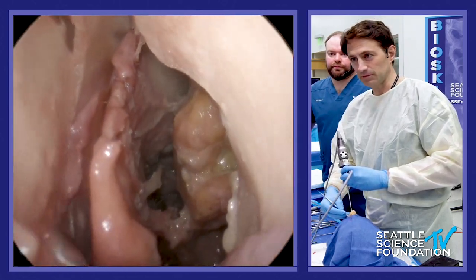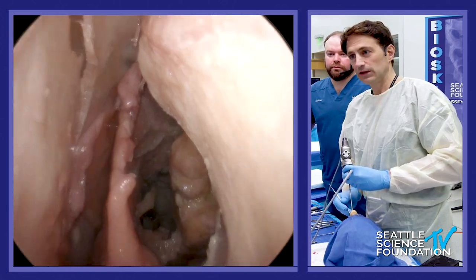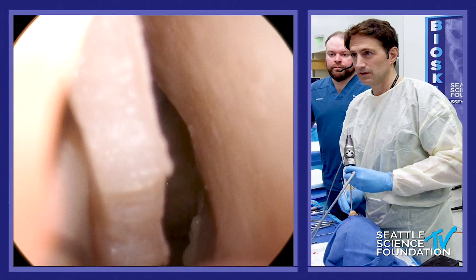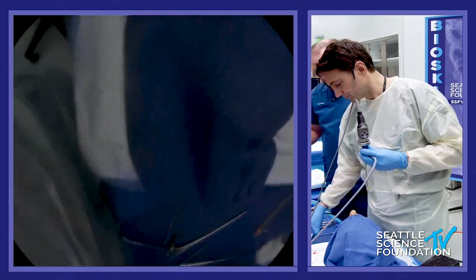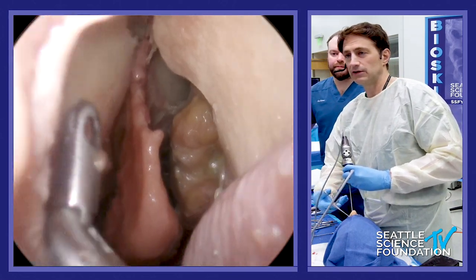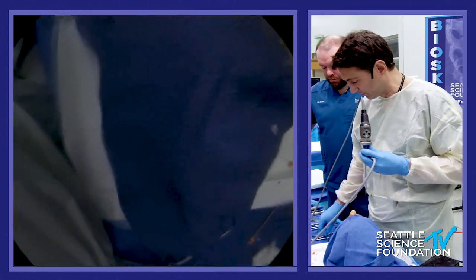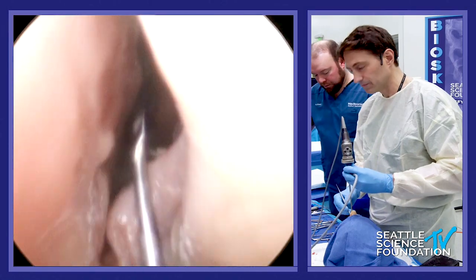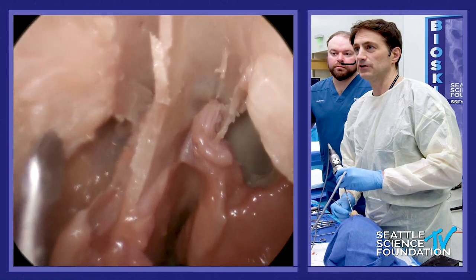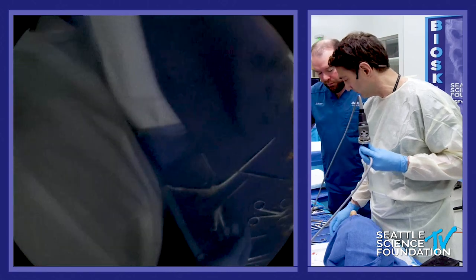The next move is of course to take out the upper septum, and this is basically in the window that you're going to make. Easy way to do this is you can penetrate lower right here. You can use a Kerrison upright there as well. Remember, you've got to keep your cartilage underneath your nasal bones and keep the support of the nose — but that portion can go. And now we've got this nice big window. We're going to go to periosteum, come up here, and we've got our frontal sinus identified — we can do this very rapidly.